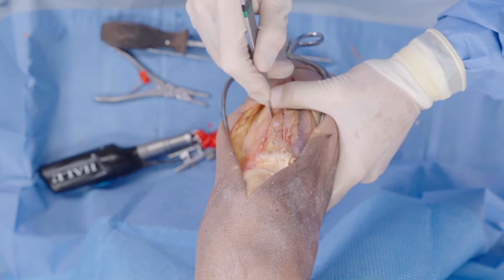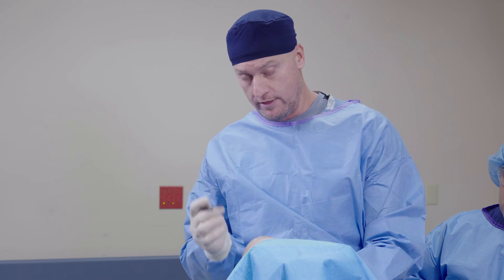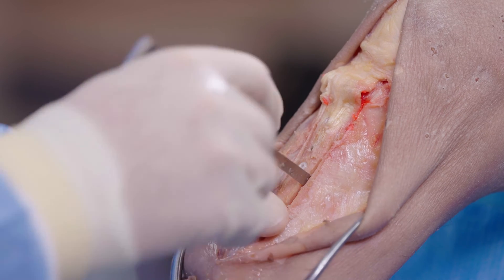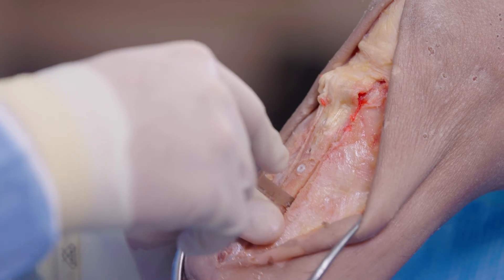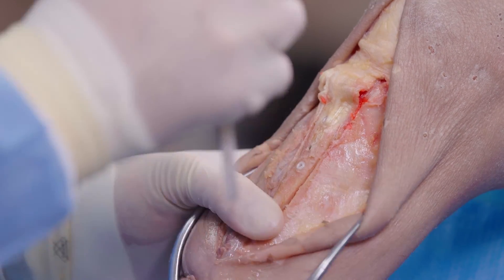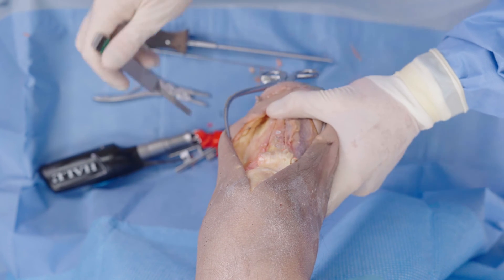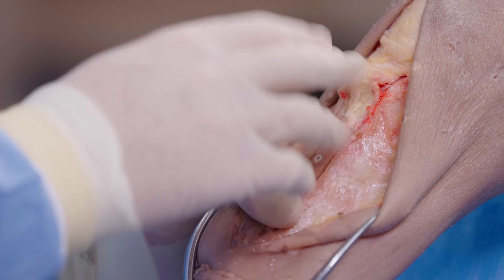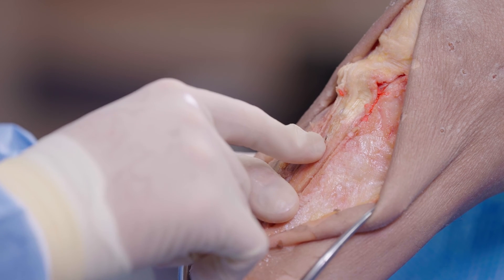I cannot pry that osteotomy site out. The MD3T system is second to none — it's safer, it's reproducible, and you can correct in multiple planes. In this case, we medialized and distalized. With the osseofiber screws, we don't have to worry about any kind of metal prominence. And what's amazing is that over the next number of months to a couple of years, that osseofiber is going to turn into brand new bone.